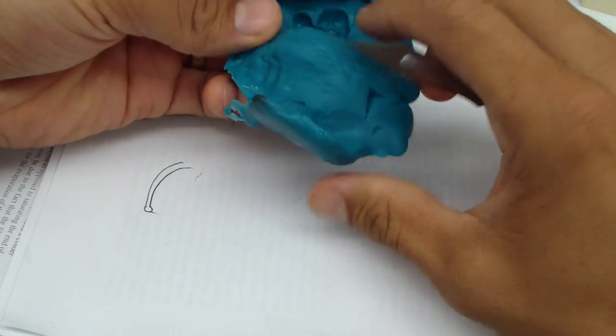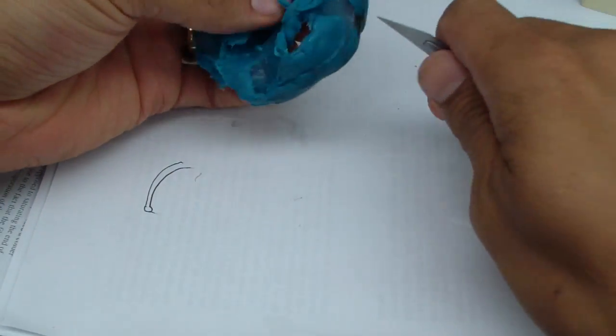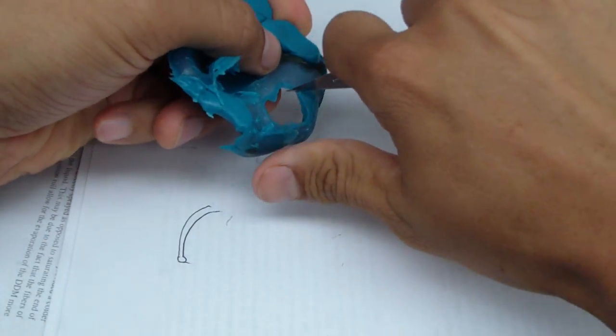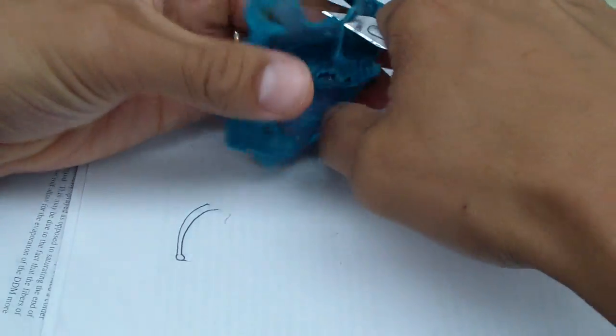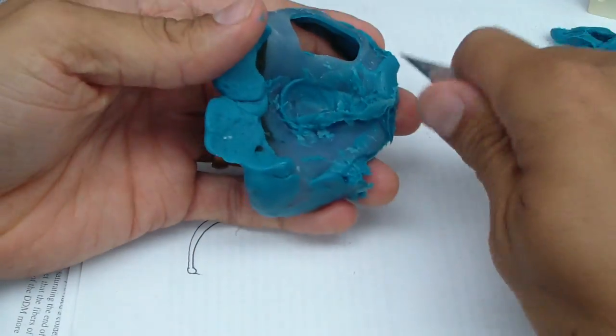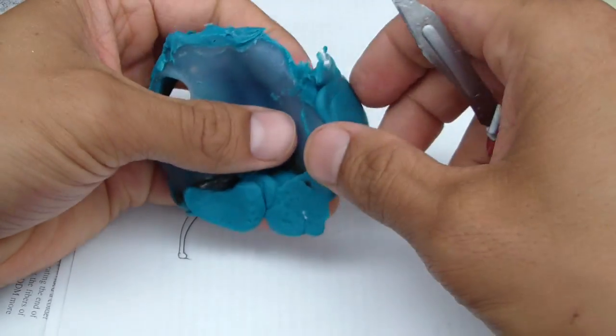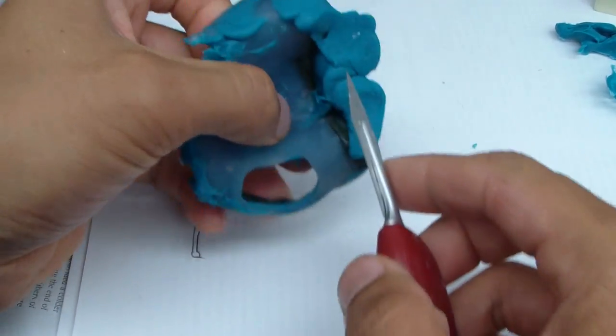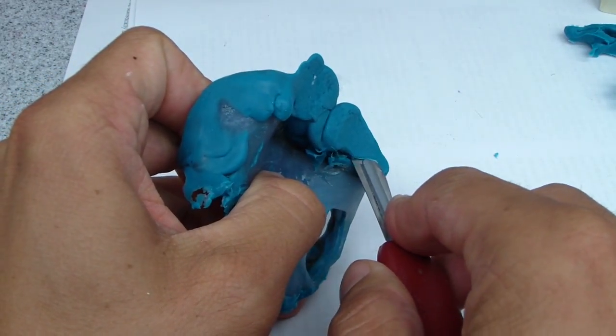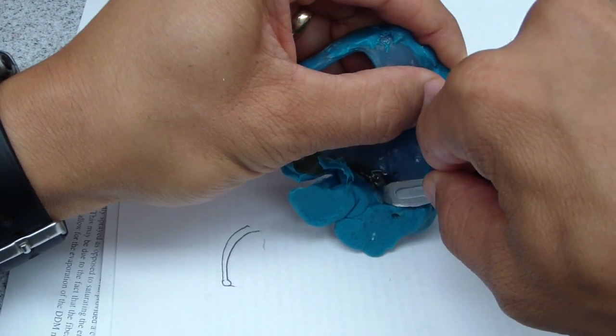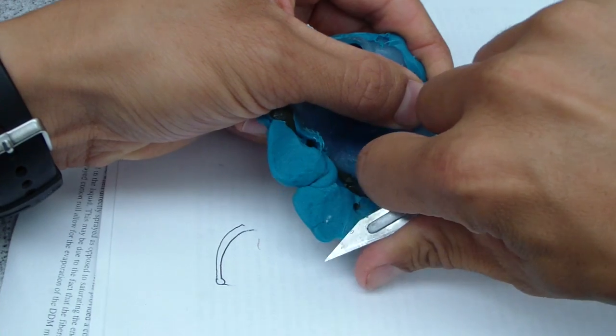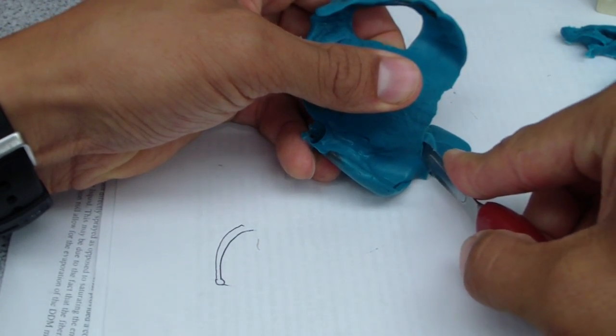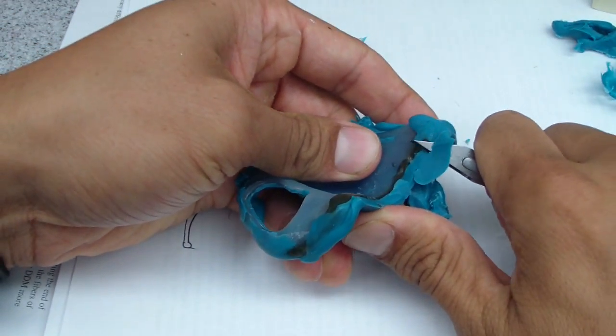Okay, so here's the wash after with polyvinyl siloxane, and what we're going to do now is we're going to clean up this excess, because we're going to now pick this all up with an alginate impression. And we're just cleaning it out, so the alginate will be able to pick up the teeth and the anterior segment. We didn't do the anterior segment in this case because it has significant undercuts, so I'd never be able to get this out. We're having difficulty getting this out as it was.